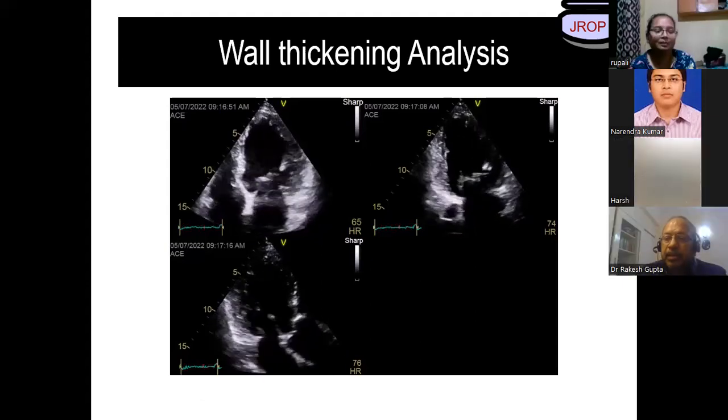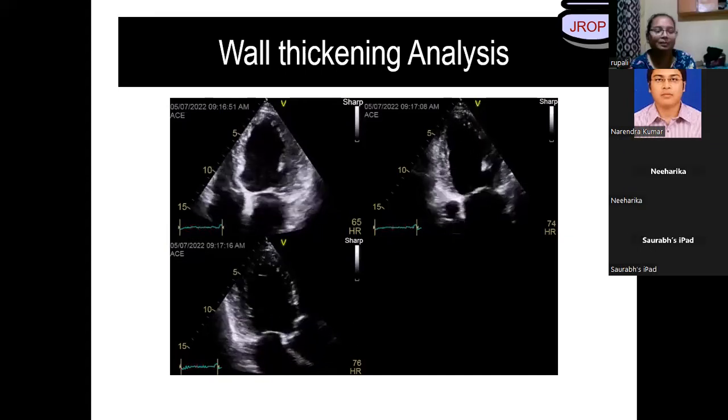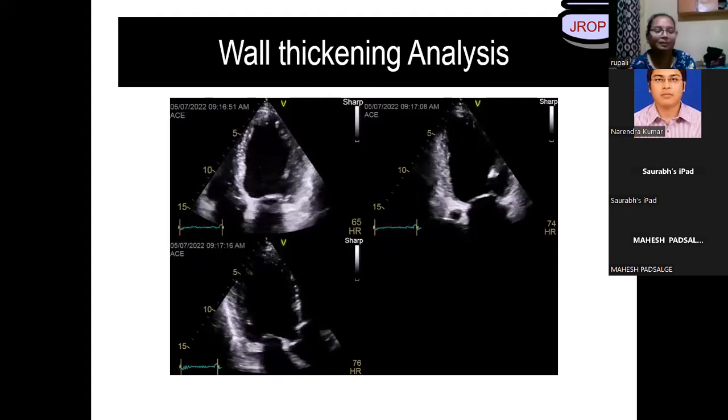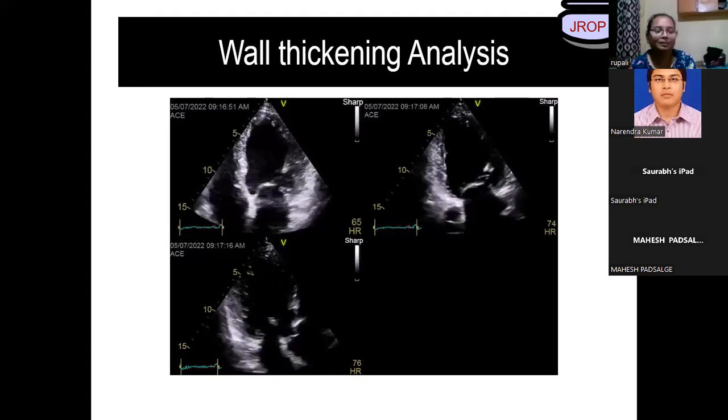Yes, sir, apical 5-chamber view, sir. This is Dr. Narendra. Apical 5-chamber view, and there is a global hypokinesia. Wait a minute. One person, one by one. Dr. Venkatesh, you are speaking right now? Yes, sir. Dr. Narendra, you are taking this question. This is apical 5-chamber view. Yes, sir. I'm sorry, you are wrong. You'll be losing marks out of this.